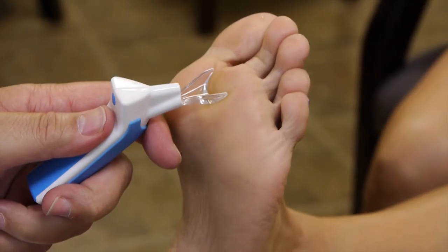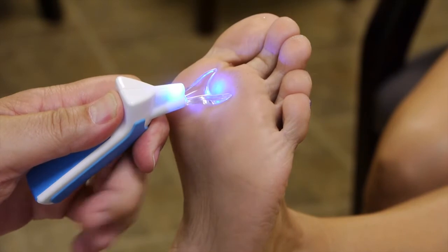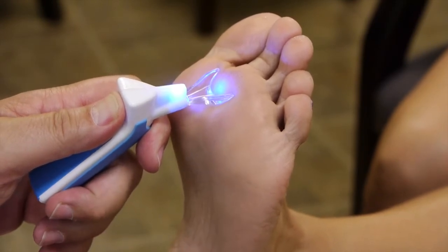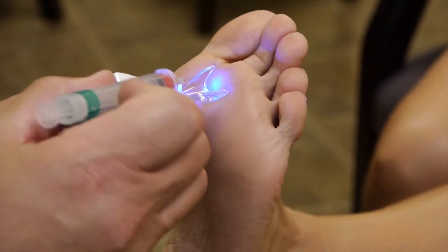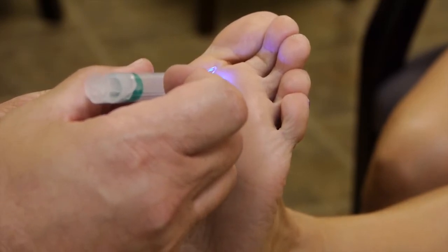One of the things that I've noticed is when I push, even if I push hard, it doesn't change the cycles per minute of the vibration. So I'm barely pushing, I'm not even touching her, and I push it on and I push, it does not change the vibration. And I just go directly where the lesion is, infiltrate the medication, and then take it out.